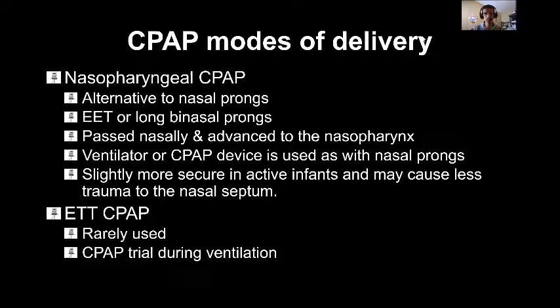Okay, I have a question. We just said that there is no indication for which one you use. Mask has more pressure because you need to fix it very well, so it gets more pressure on the face. While with nasal prong, you don't need pressure, but nasal prong will press on the septum, so you'll have more septal injury. So most units use nasal prong post-extubation. When you start having septal problems, you switch to the mask. But some of the units switch between nasal prong and mask CPAP.